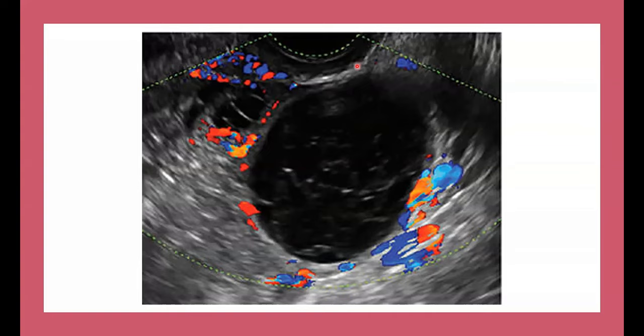Now, clearly, this is the nearest area. It's also an area of increased density where there's a large difference between the acoustic impedance of the fluid or the gel that's allowing these probes to come in, which is causing reflectivity. That reflection going back is producing a bright area over here. This would be how the pleura would appear. It's linear, it's hyperechoic. A very similar appearance you would see, for example, if you wanted to look at the pericardial margin when you have a pericardial effusion.